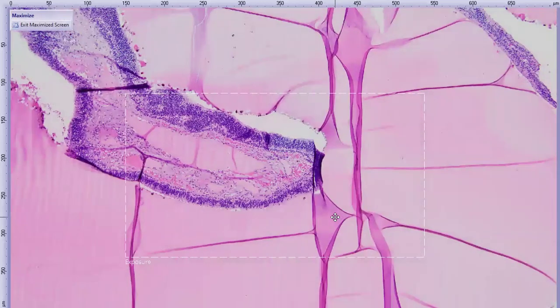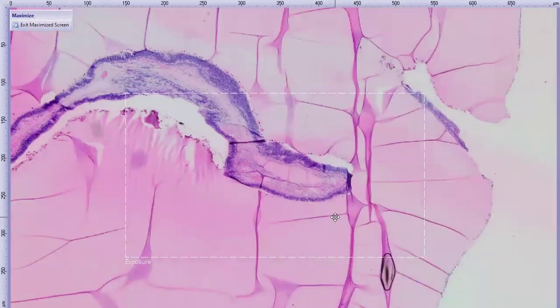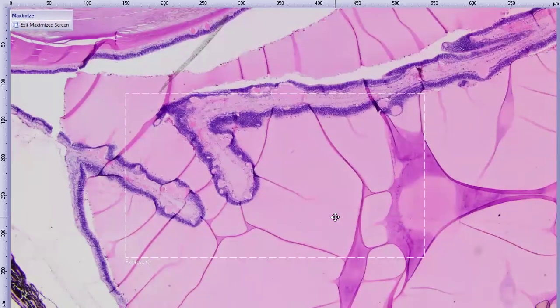Here's the retina, extensively detached, as we've seen, right? Let me go one lower so we can actually appreciate. So this portion of the retina is connected to the optic nerve head, and it kind of opens up forward, what we call a morning glory retinal detachment, as in the flower morning glory, right?